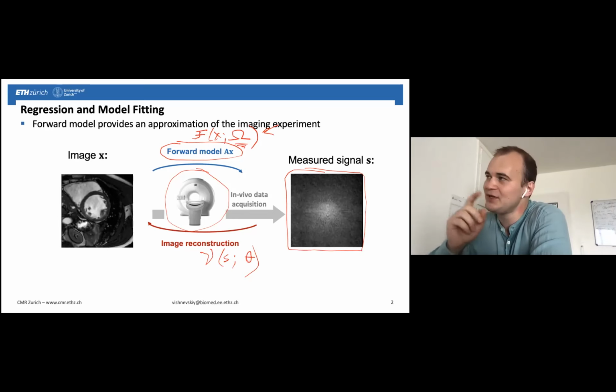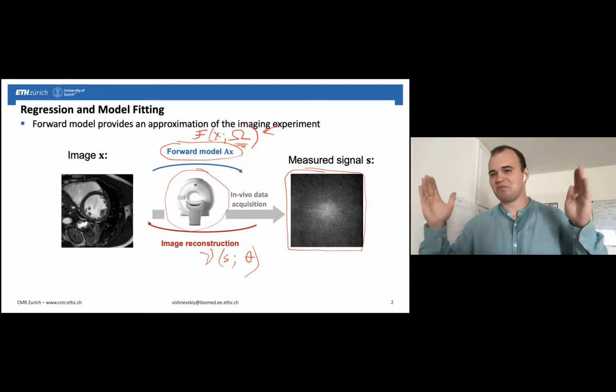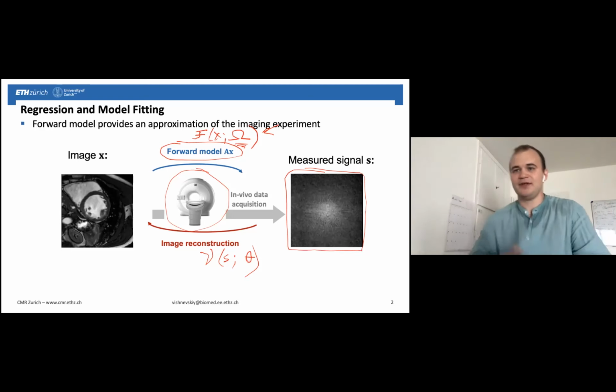And just to give you one example, sometimes you want to model the full pipeline for estimation of some tissue parameter, and the image reconstruction can be only part of it, or it might not even be needed to reconstruct what we want, but it can be used as additional information. So we can provide very simple networks that are quite fast and have very few parameters, but they can be tunable and they can provide these estimates quite accurately.